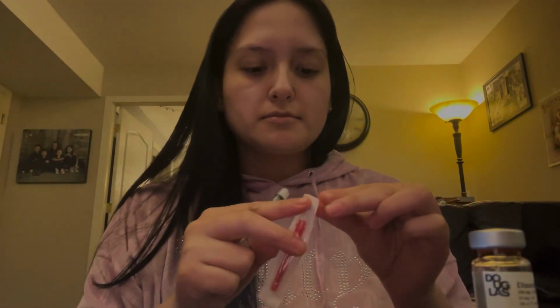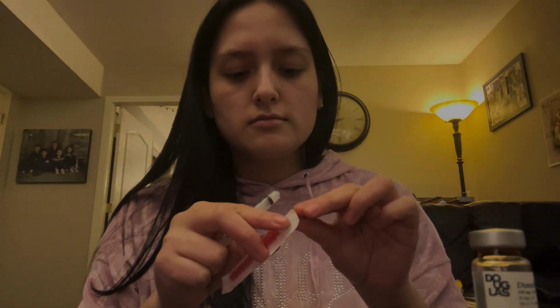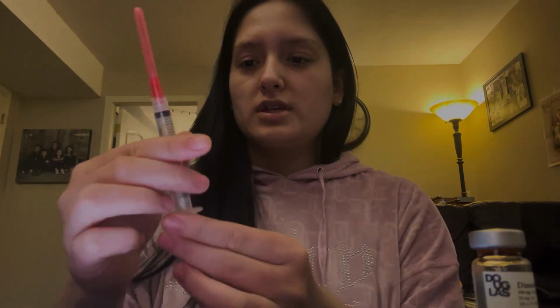And so now I'm going to prepare my first medication, which is going to be the Gravol. I'm going to be putting 0.5 mils into a 3 milliliter 23 gauge syringe. I'm going to be placing the blunt fill needle onto it to extract it from the vial. The first thing I'm going to do is draw up 0.5 mils of air just to aspirate it.